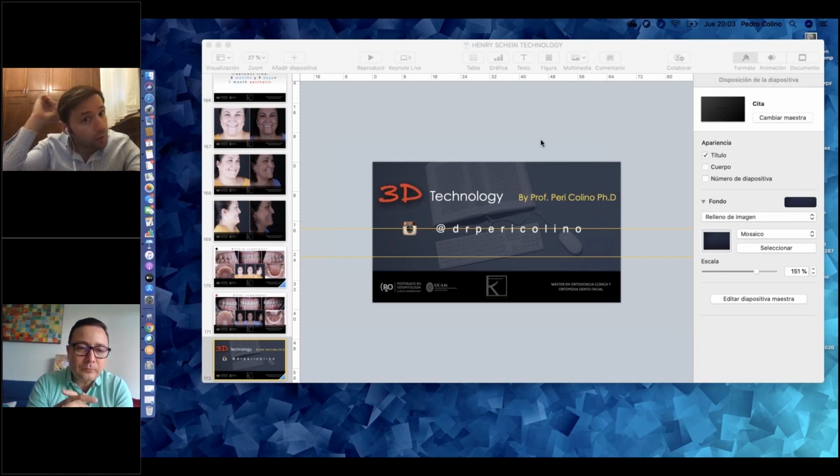I like to put lace back in the lower arch between 6, 5, 4, and canine, and I usually use, from the lower first premolar to the upper first molar, short light elastic at night in order to maintain what I did in the last phase. Okay, this is the best option to maintain what you reach.